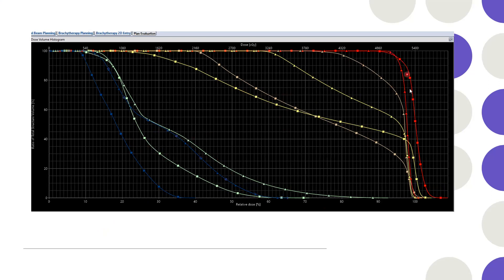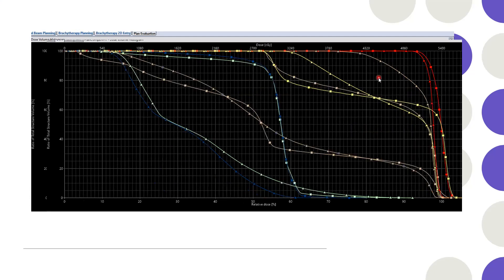But you can see the sharp falloff of the PTV. Comparing with 3D CRT, the major difference is on the femoral side — 3D CRT gives a higher dose to the femoral. As for the rectum and bladder, the low-dose region is better in 3D CRT compared to DCAD, but the higher dose region is lower in DCAD. The same result applies to the bladder as well.